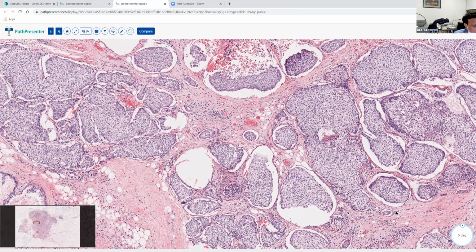Okay. I have a question. What about the opposite situation? For example, in that papillary DCIS, when you had a small area of invasion, or in solid papillary carcinoma here, where you have a small area of morphologic invasion at the periphery, if you have intact myoepithelial stains in there, would you rule the invasion out, or would you just base it on morphology?